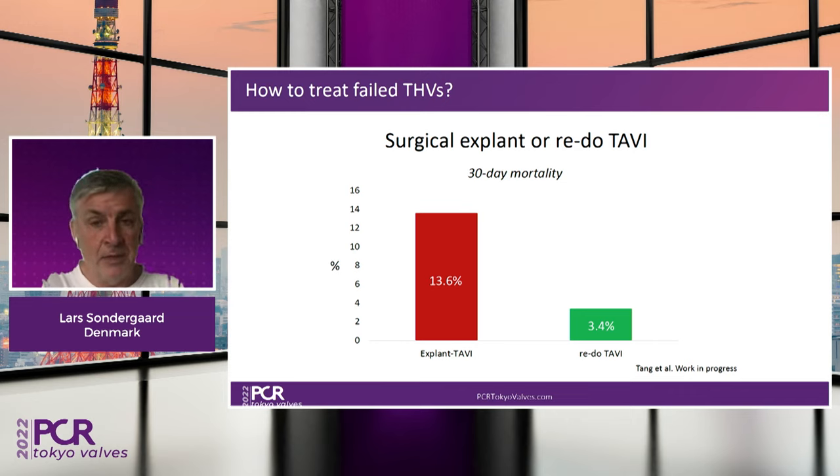And also, what is the durability of these valves? And still, we have limited knowledge about durability. But there's no doubt if you're going to move down to patients at 65 years of age with pretty long durability, these valves will eventually fail, no matter what the durability is.